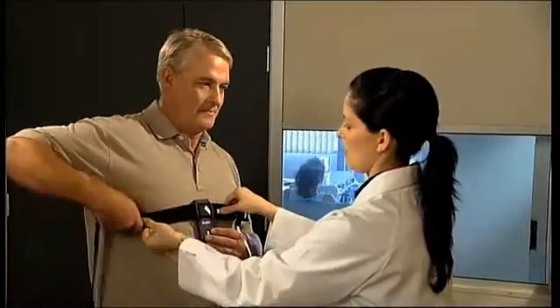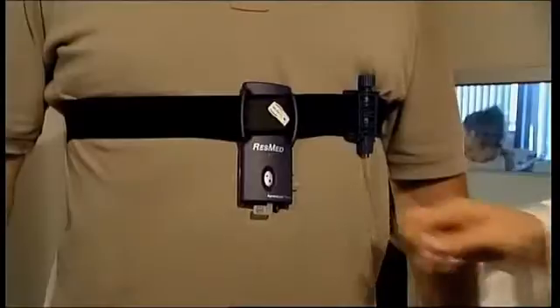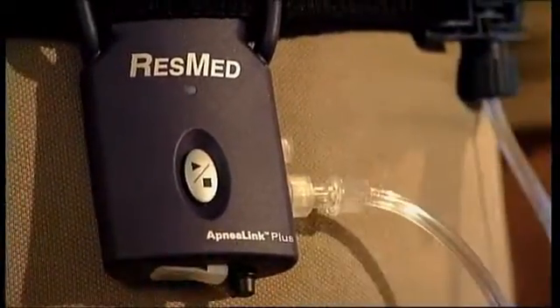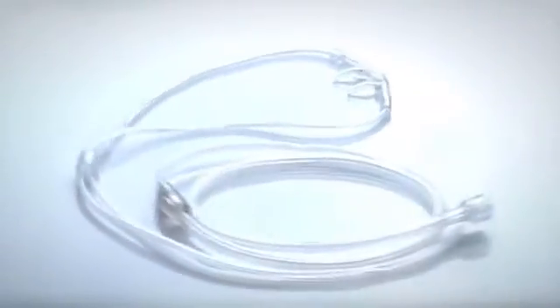You can then assemble the ApneaLink Plus system for your patient. Attach the assembly to his chest and tighten the belt to a comfortable level. Then connect the tube from the effort sensor to the ApneaLink Plus with a twist. Now you can show him how to attach the nasal cannula to the system.